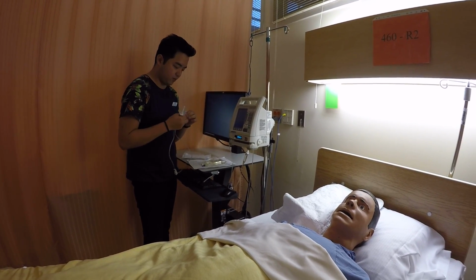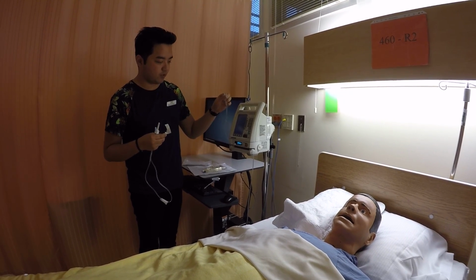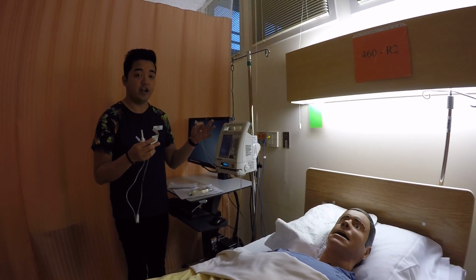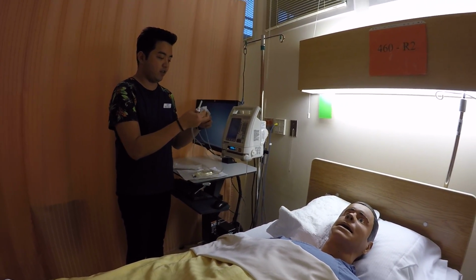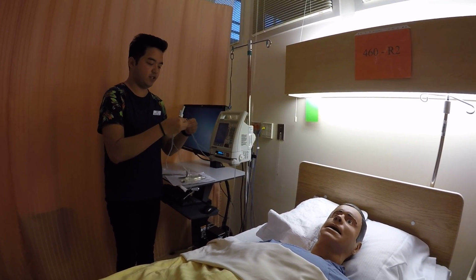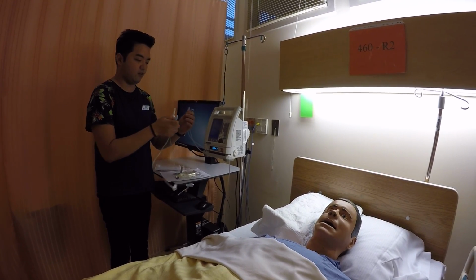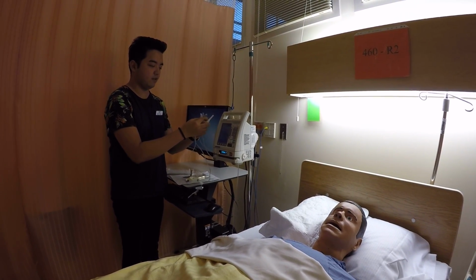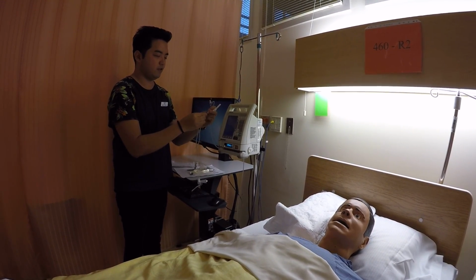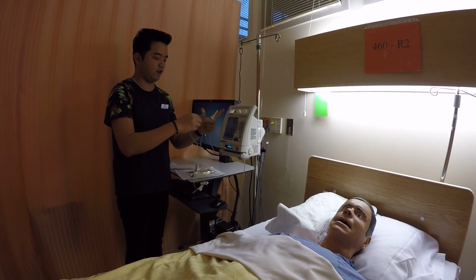And now, what we do next is choosing the port. So I choose the port before the Baxter pump because we want the Baxter pump to also control the secondary infusion, okay? So you just need to clean this for 30 seconds, let it dry for 15, and then we are ready to connect. Okay. There you go, so it's connected.